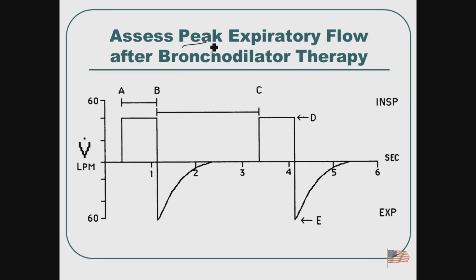Normally, when you're in the ER and you're giving a breathing treatment, how do we know that it works? We give them a peak flow. We monitor the peak flow prior to the therapy. We monitor the peak flow after the therapy. And we can say whether or not it improves. This is peak flow.